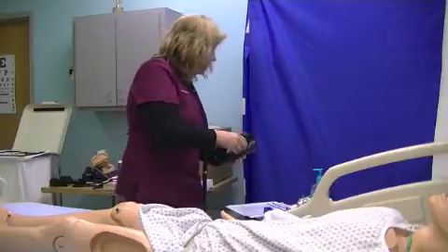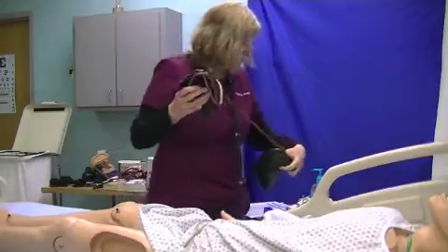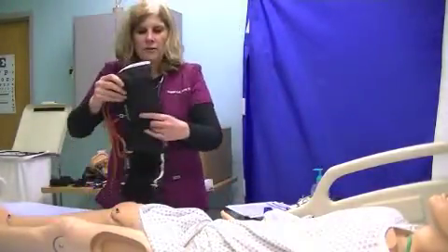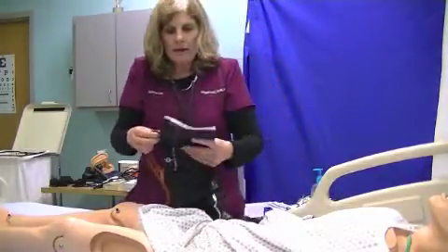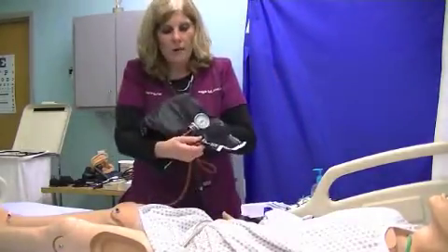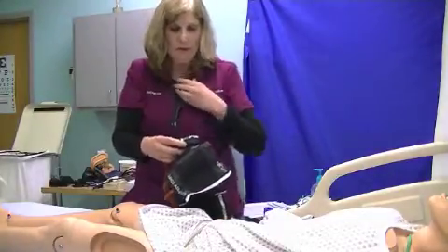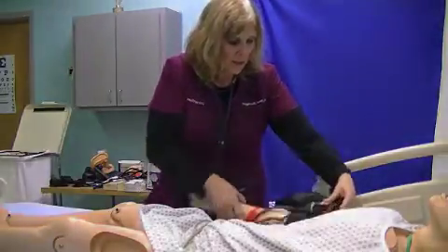When you go to put the blood pressure cuff on, you want to make sure you have the right size cuff. The cuff should wrap 2/3 around the arm. This is called a sphygmomanometer. It has a manometer here. This is an aneroid manometer. It's a dial manometer. We no longer use mercury in places because that was dangerous to people's health.